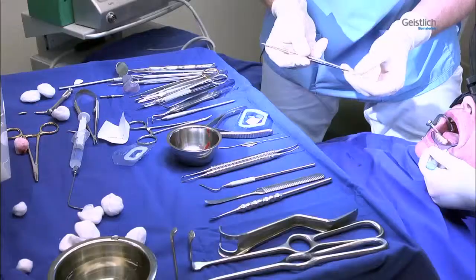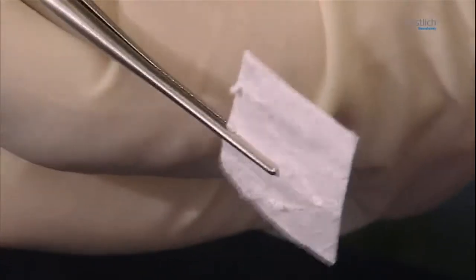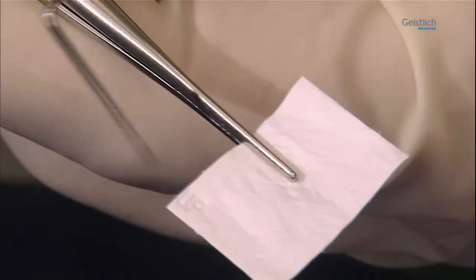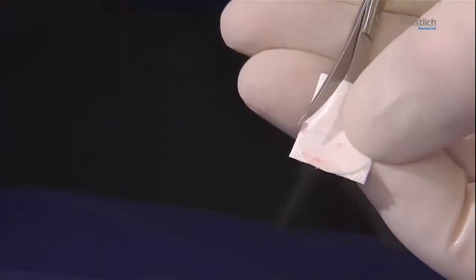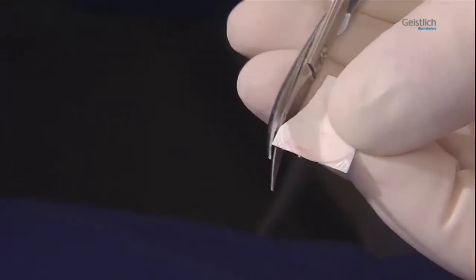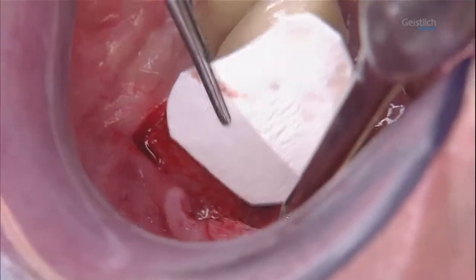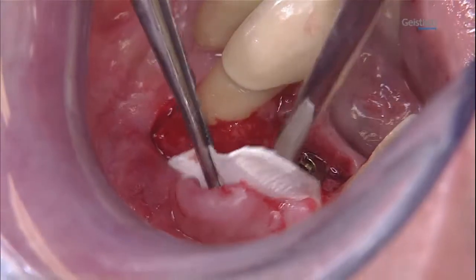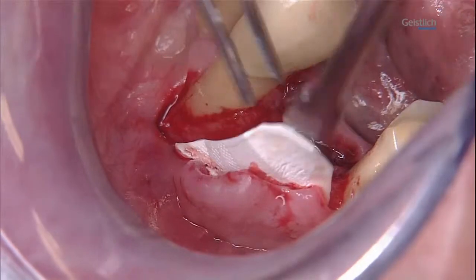The 16 x 22 mm Geistlich Bio-Gide has two differently textured sides. The outside of the membrane is marked with the embossed word "up." The shape and dimension of the template are now transferred to the membrane. The embossed "up" can be clearly seen here again. Once the membrane has been cut to match the template, its broader base is first pushed under the mucoperiosteal flap. The collected autologous bone is applied in close proximity to the implant.